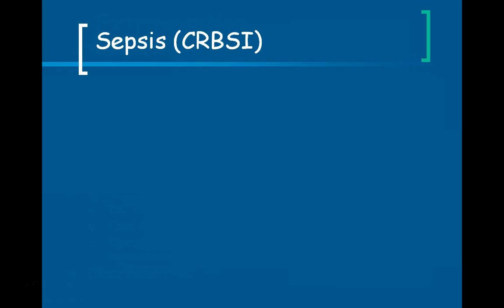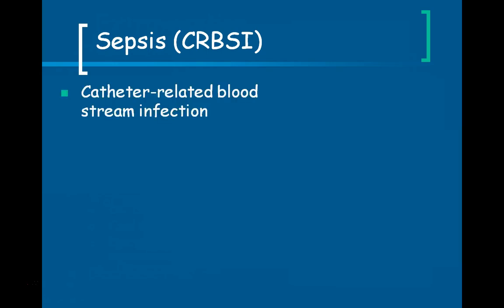Sepsis, or CRBSI, which is catheter-related bloodstream infection. This is a systemic infection, very dangerous. And sepsis is something that is 100% avoidable.